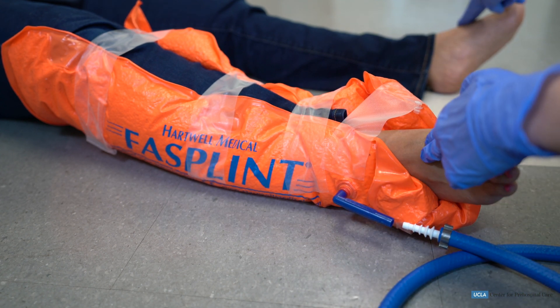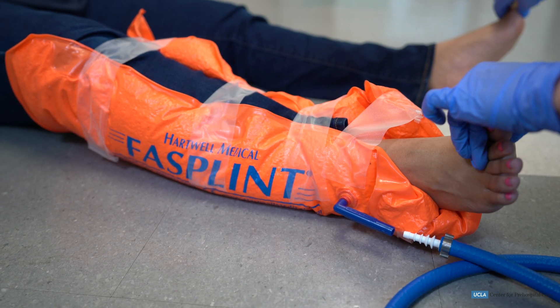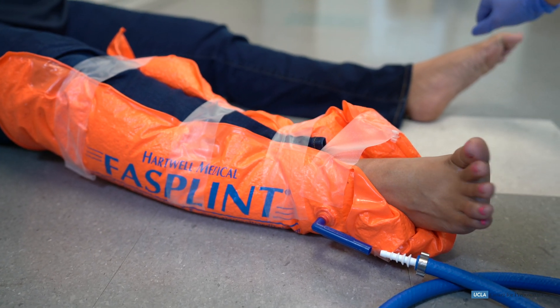Before splinting is complete, the EMT will ensure circulation, motor function, and sensation distal to the injury are present.